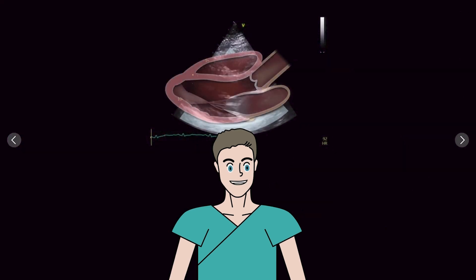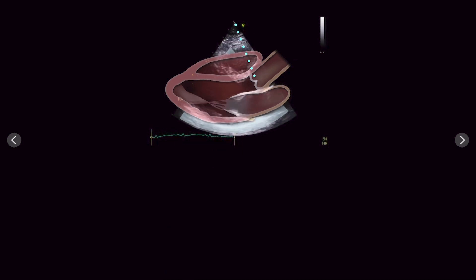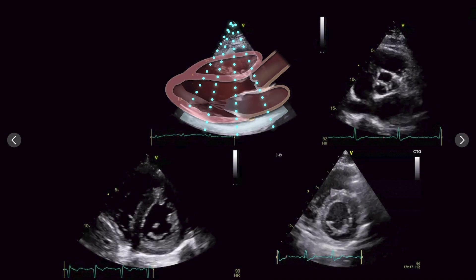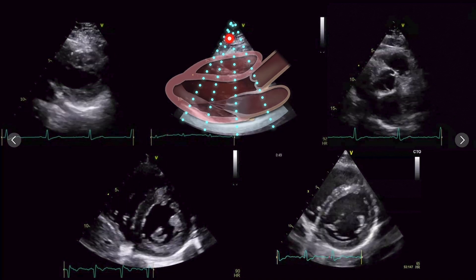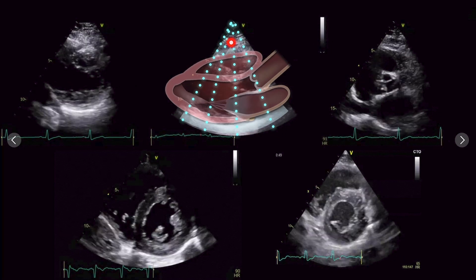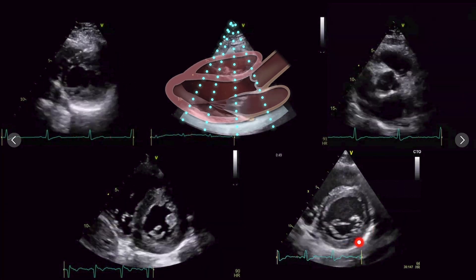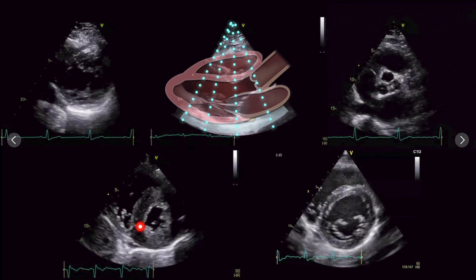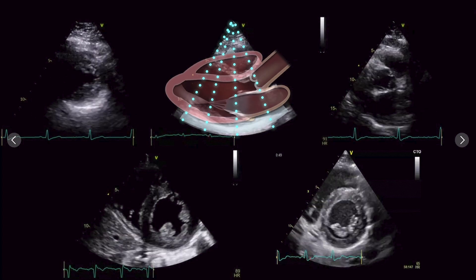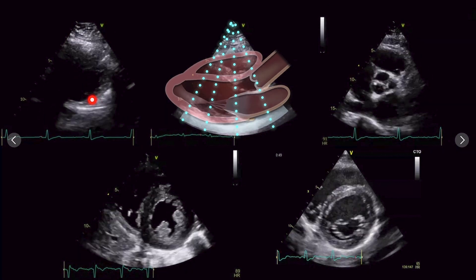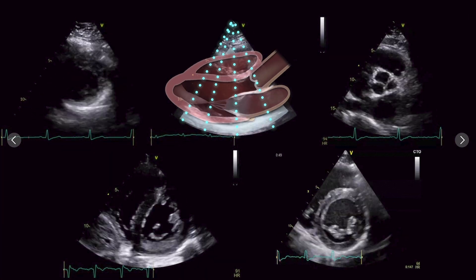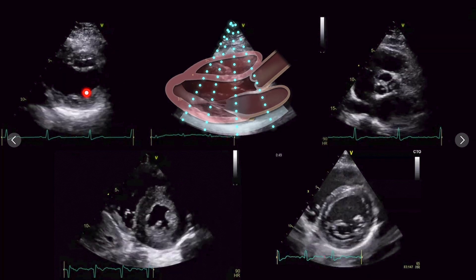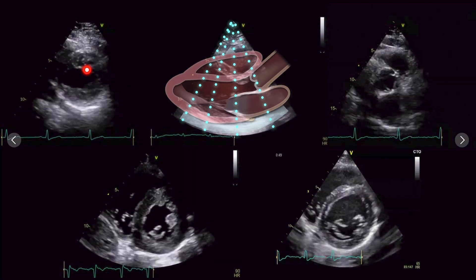Let's review all the different cut planes available with the parasternal short axis. We start at the level of the aortic valve, then continue to the level of the mitral valve, then the level of the papillary muscles — where you can see an example with thickened papillary muscles and thickened left ventricular myocardium — and continue to the apical regions. In the apical view, you can see hypertrabeculations, which represent a rare cardiomyopathy — non-compaction — with this characteristic spongy appearance.